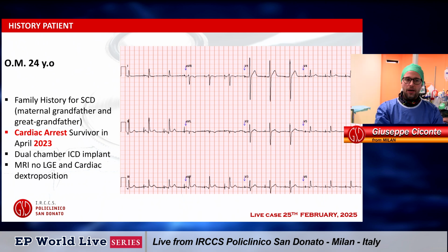However, to give you the big picture, he survived the cardiac arrest, and this is the ECG that we face. So clearly an early repolarization pattern with a malignant form, a phenotype expression of the disease. Next slide, please.